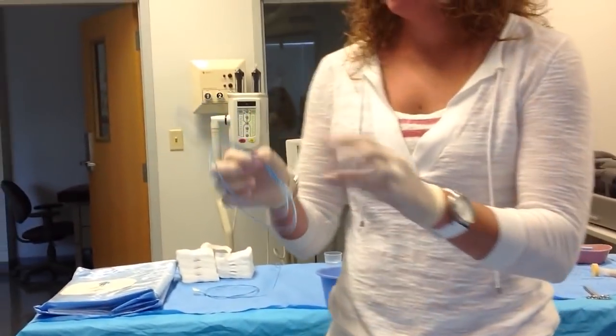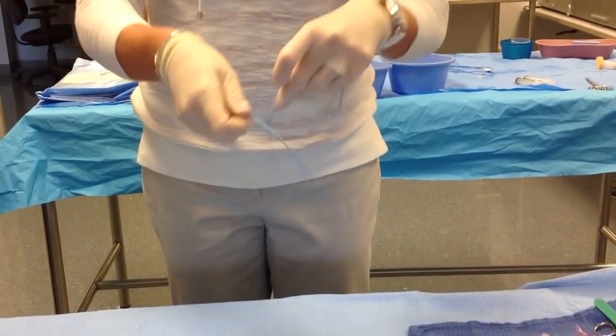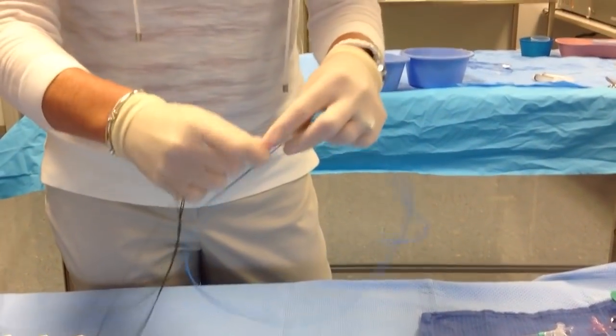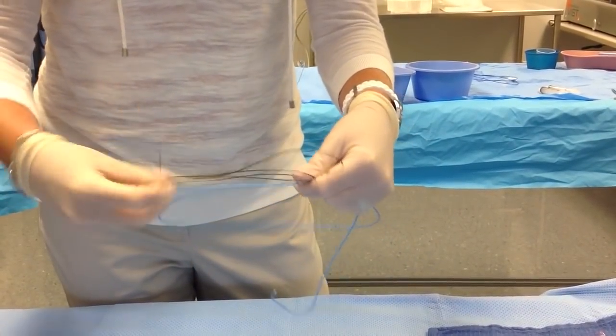We're going to start with the JL4. So I'm going to load this with our wire. It's better just to have it one circle because they get all tangled up. So you're just going to load this. You have this all twisted up.